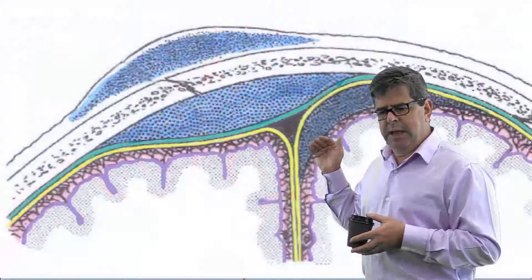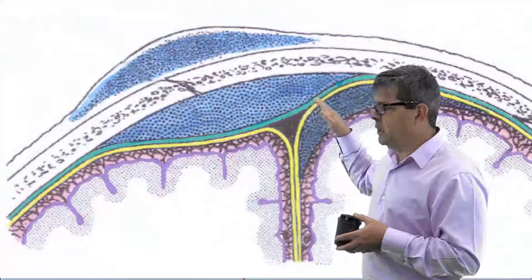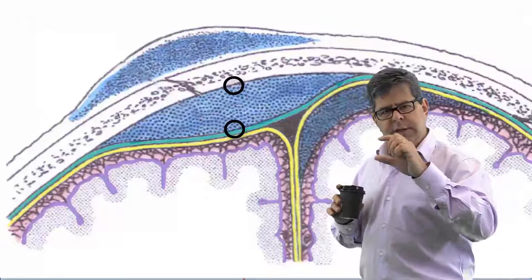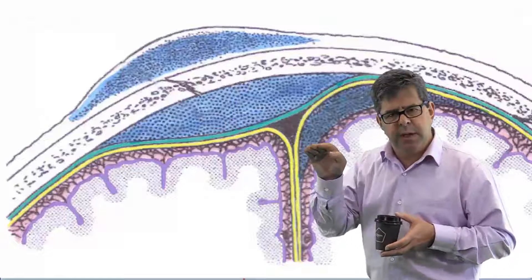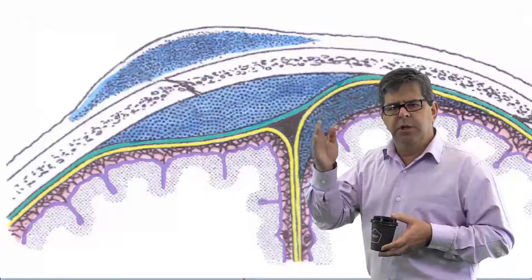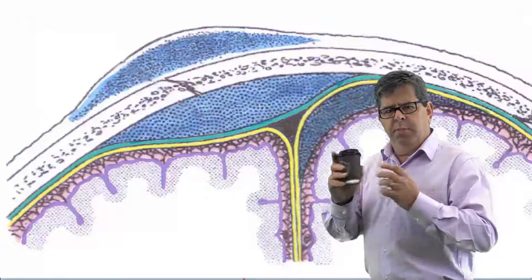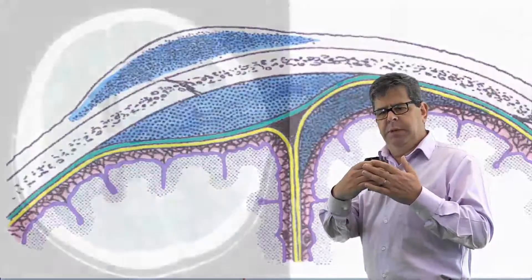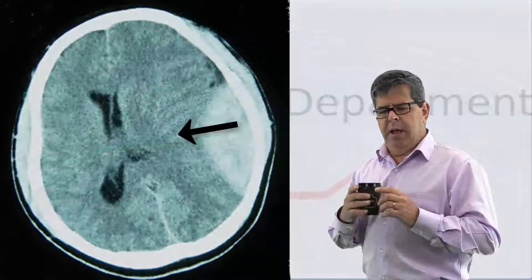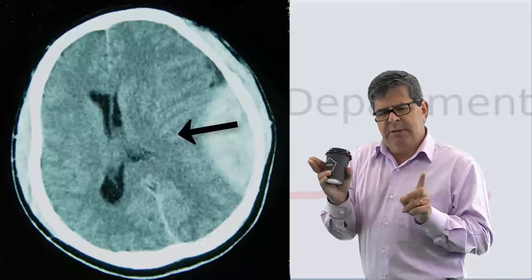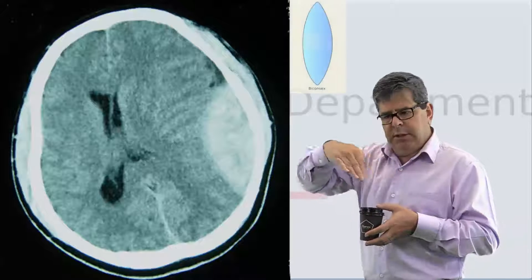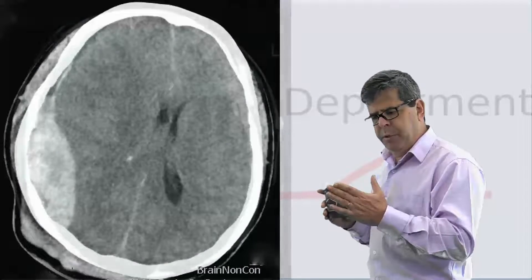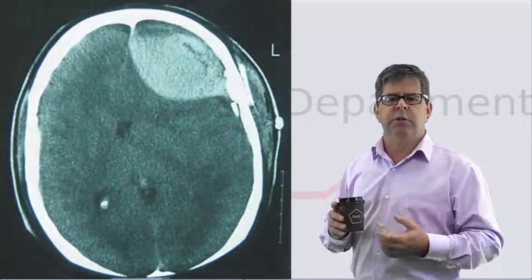Now on to the very important extradural hematomas. Extradural hematomas occur in the extradural space — from the inner surface of the skull to the outer layer of the dura. It's a potential space, but inside it are things like the middle meningeal artery. If you rip those arteries from injuries — say you get smacked with a baseball bat — the artery will bleed and compress the surrounding brain. Because it's under pressure and limited by the cranial sutures, it tends to have that characteristic lens appearance, which we can see on these CTs here. It compresses the surrounding cerebral tissue under high pressure, which is why it's such a neurosurgical emergency.